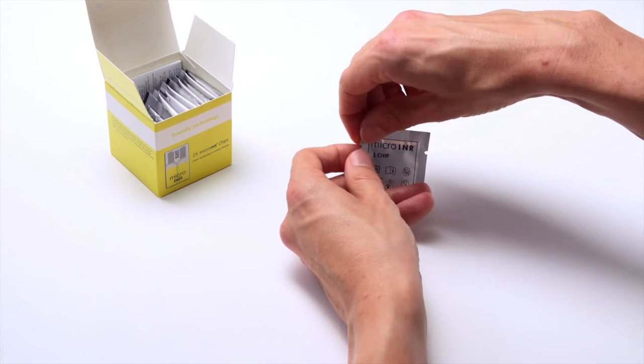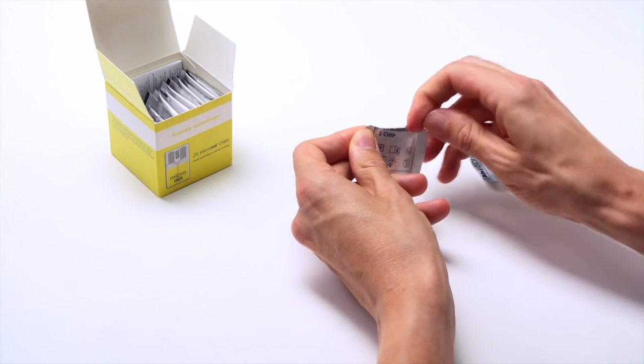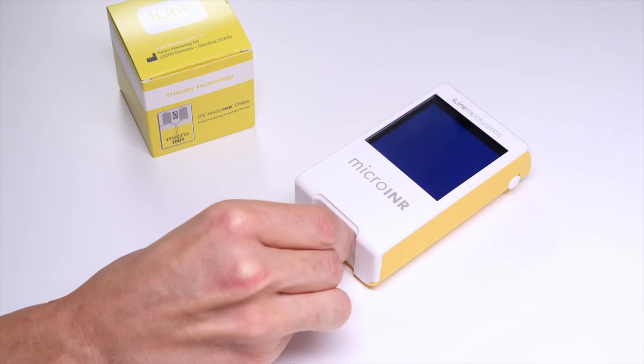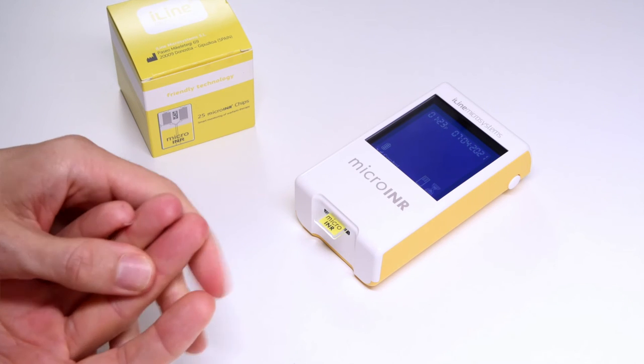Remove a chip from its pouch and hold it by the yellow part so that the Micro-INR logo can be read correctly. Insert the chip into the slot and push it until it stops. The meter will turn on automatically, and a flashing hourglass appears on the screen.